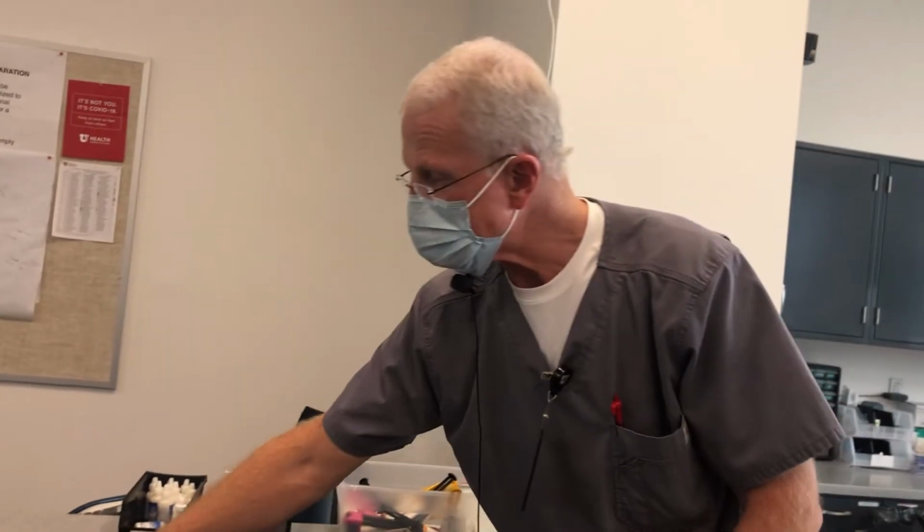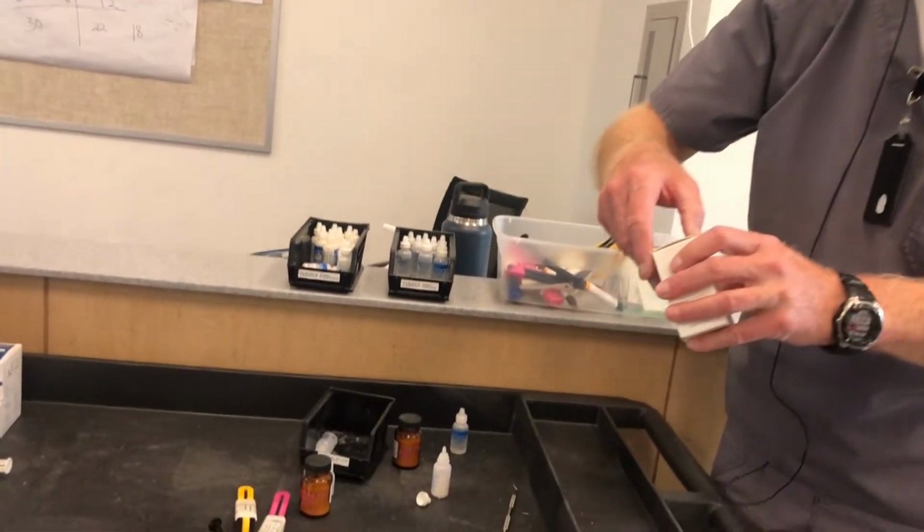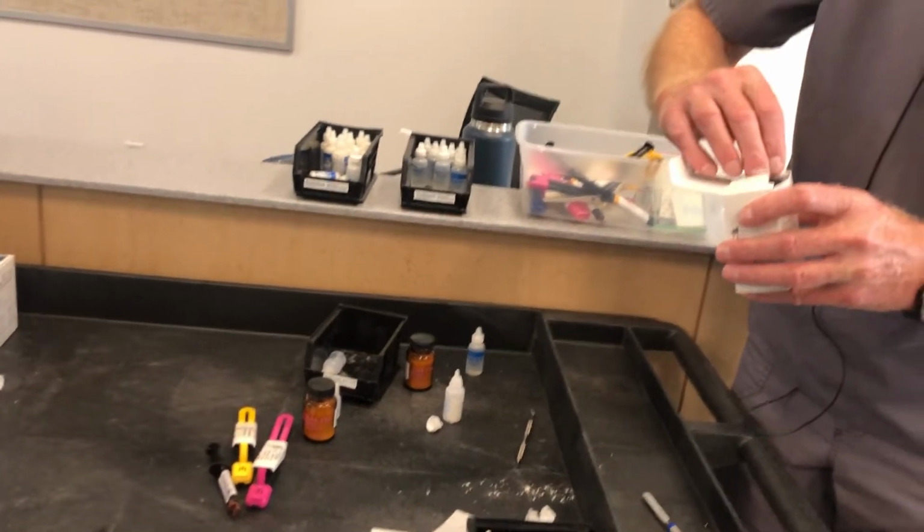And like it says there, it says dual cure on it. That means either light or chemical or both, right? Dual cure. So those are pretty much the final cements. Temporary cements, well, before we go to temporary cements, IRM is another material that you will use.